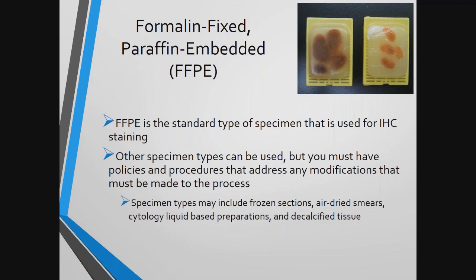The takeaway here is that it must be clear and formally stated what types of specimens your lab has validated with every IHC protocol, and then only those specimen types can be used for those protocols unless additional validations are performed.